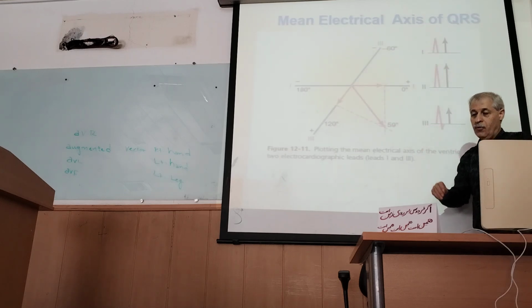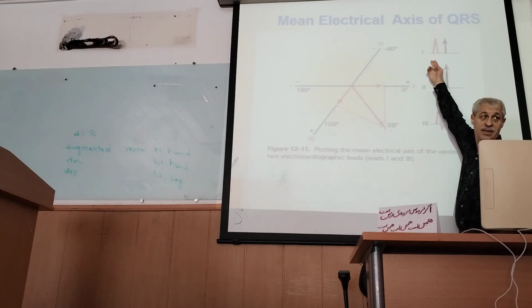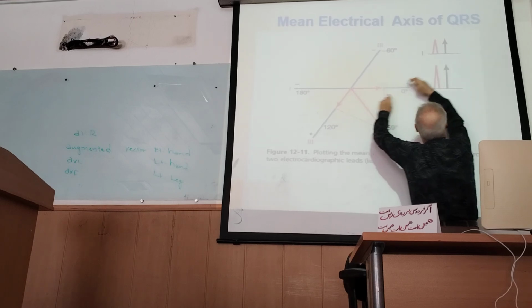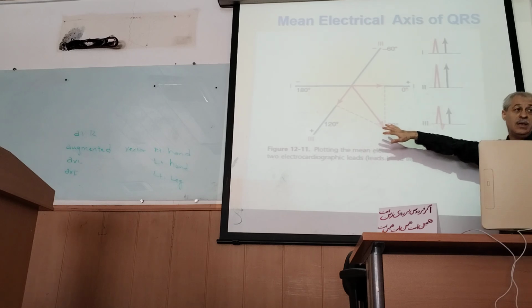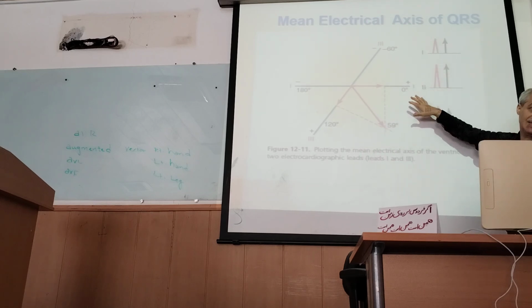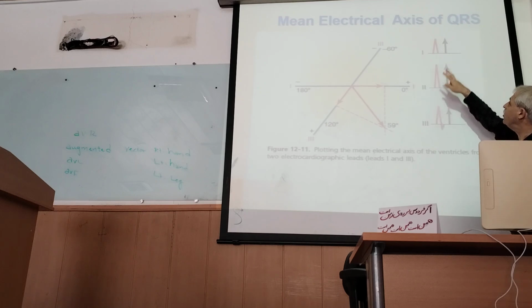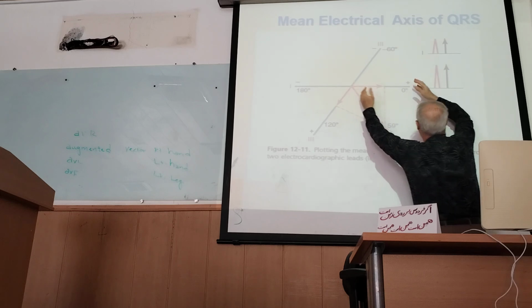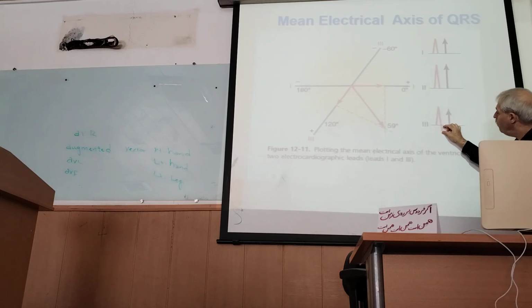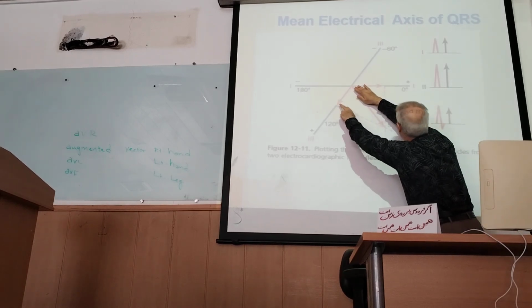See? For each millimeter, for example, or 1 centimeter, how much is it? For example, 3 centimeters. 5 centimeters. See, in this example, the author uses, this is actually taken from the guidance book. If you have brought the respective page, you can see this one. From limb lead 1 and limb lead 3, in limb lead 1, you have this amount in the positive end. In limb lead 3, the negative end is subtracted from the positive one. See, here you have this amount.